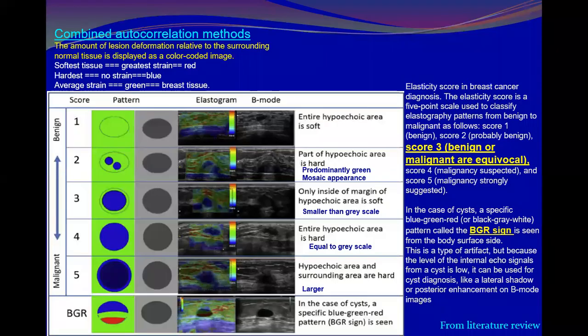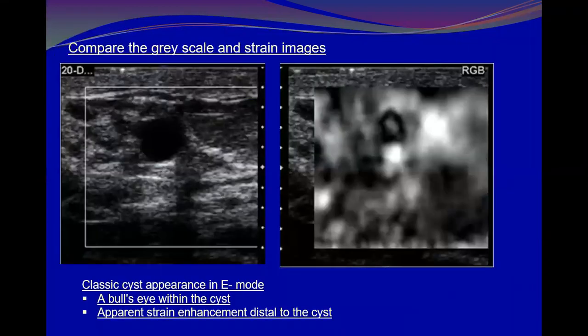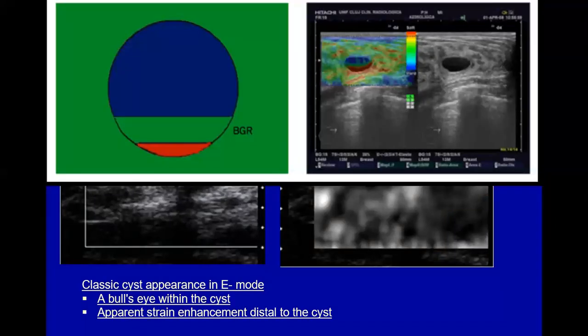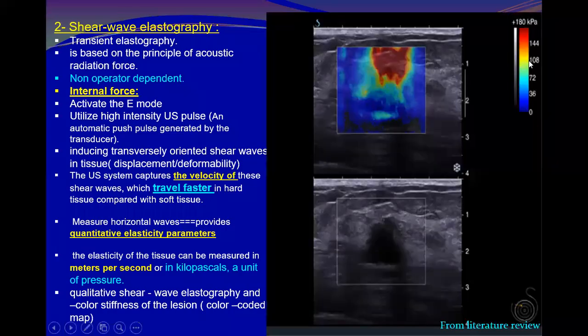Mostly green, blue, green. These colors, okay. But here, look here: red, then yellow, then green, then the blue, okay. And even the green is borderline. The green here is borderline. It is around 70 to 80, okay. And the yellow is above 100.